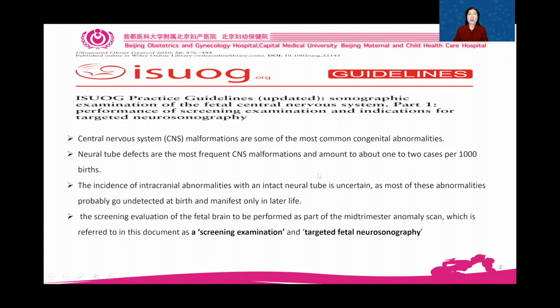This year, ISUOG published a new guideline about the fetal central nervous system. Part one is the performance of the screening examination.